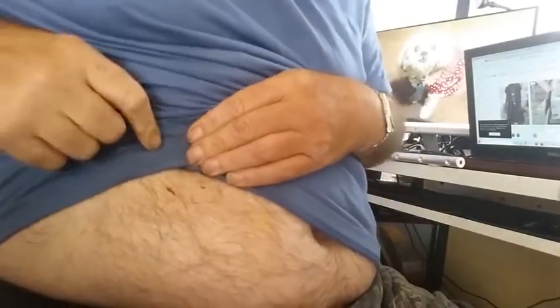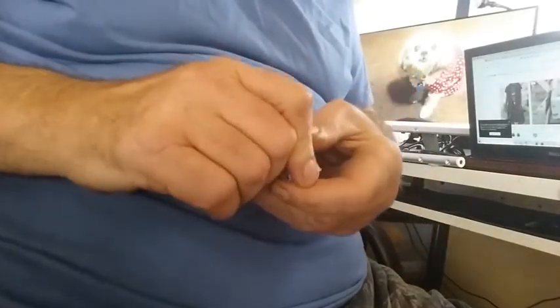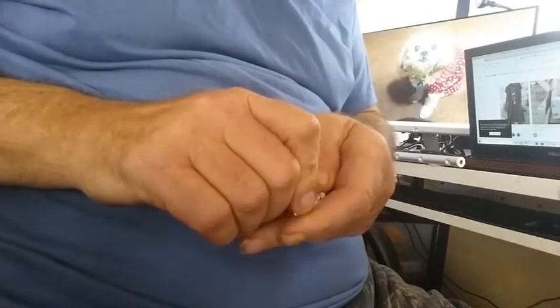A lot of people are saying, oh, it's gross. Now you've got a little blood there. It's not a big deal. That's very rare, actually. Sometimes when you hit a new spot where you're not usually in the same area, it can cause that, for whatever reason, cause blood. I wipe it off with an alcohol pad, and you're done. And so my big hairy stomach, you don't have to look at anymore. But that's it, basically, a how-to.